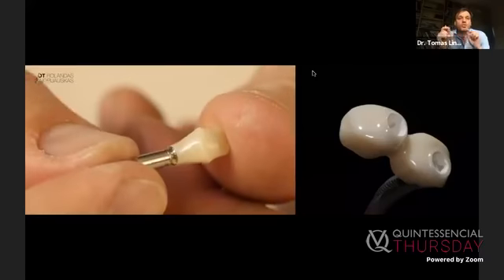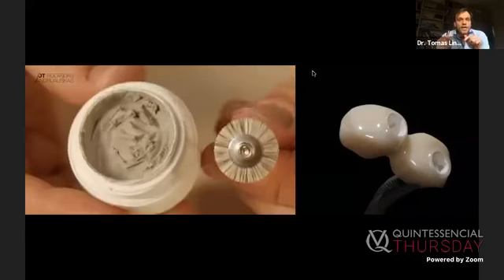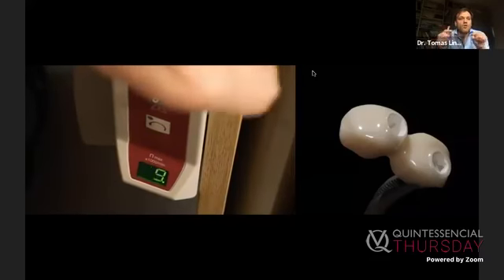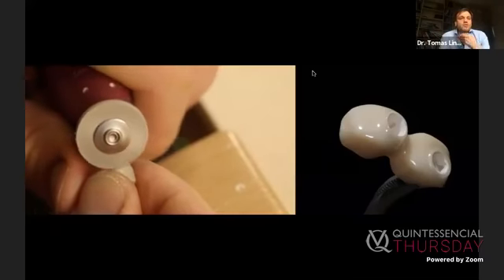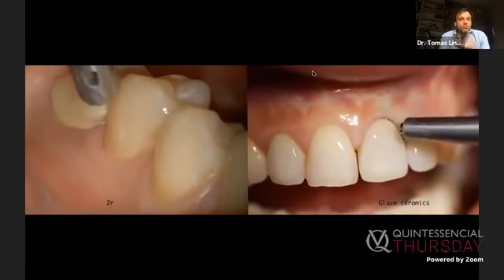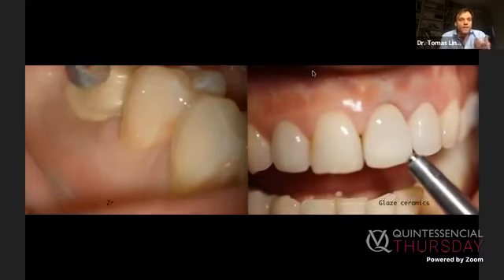Now we have a special protocol how to polish zirconia. Again, I must emphasize that I would not consider it an ultimate savior of the implants and the tissues, but in our experience, it really works well. And I see only good growth of the tissues around super polished zirconia, like the case I just showed before.